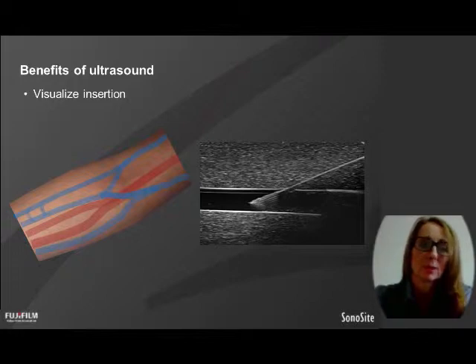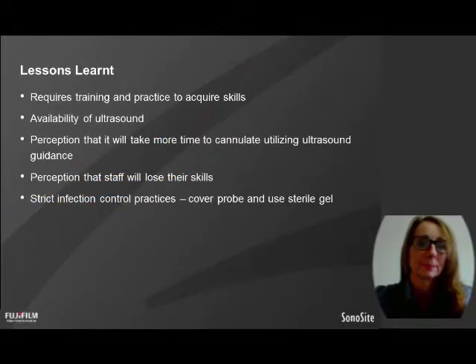It also helps us to insert into the correct vessels. Sometimes we get reports of puncturing what we thought was a fistula and then getting a big hematoma. And when you look on ultrasound, you realise that the artery and the vein were sitting very close together, and it's possible that the puncture was actually through the vein and into the artery.